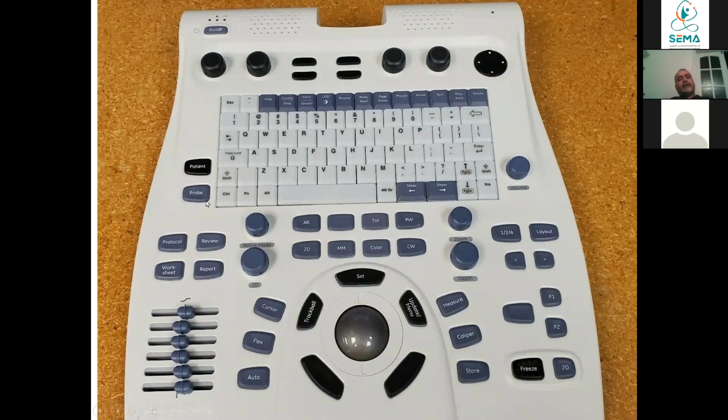Anyway, after you select the probe, just put the jelly and check the probe, because most of the machines have 2 or 3 probes attached. So you check that this probe is working. Just put the jelly and look at the machine. You see it's working. So this is a probe. We will not go into the different details of the machine, but the most important.